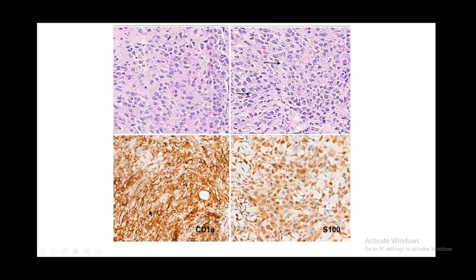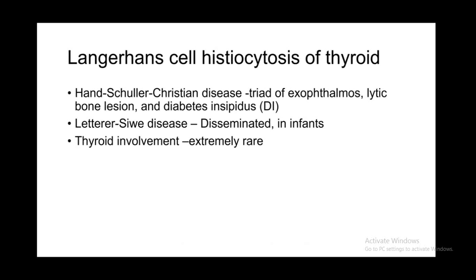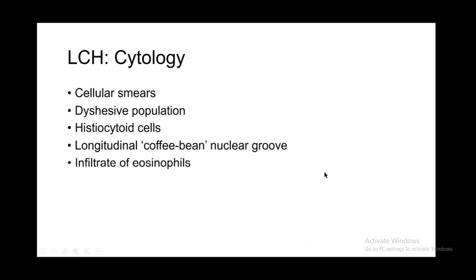This was confirmed with immunohistochemistry with CD1A and S100, and a diagnosis of Langerhans cell histiocytosis of thyroid was given. There was no evidence of any disease elsewhere, and there were no bony lesions. Now, thyroid involvement by LCH is extremely rare, with less than 75 cases reported.